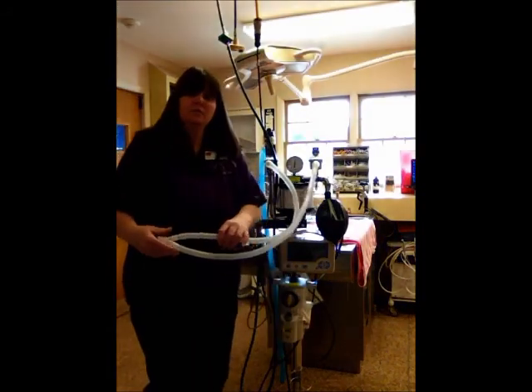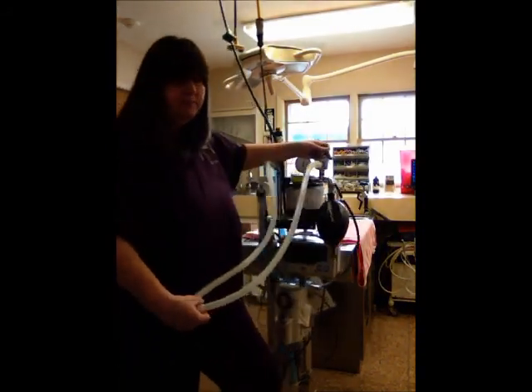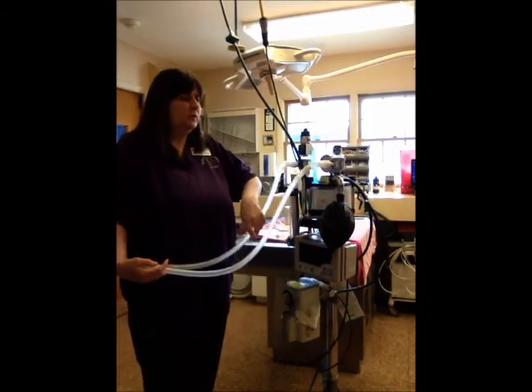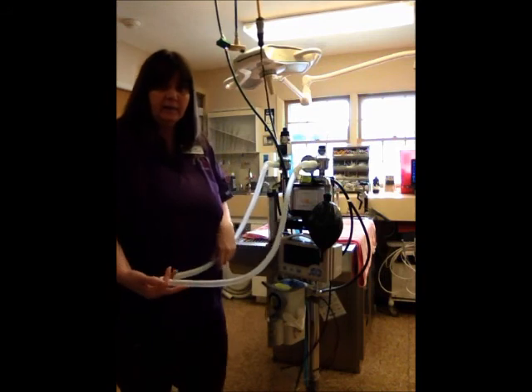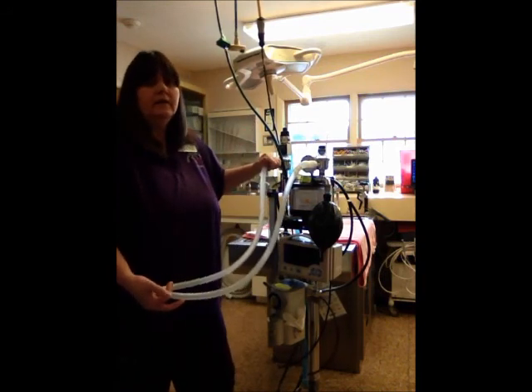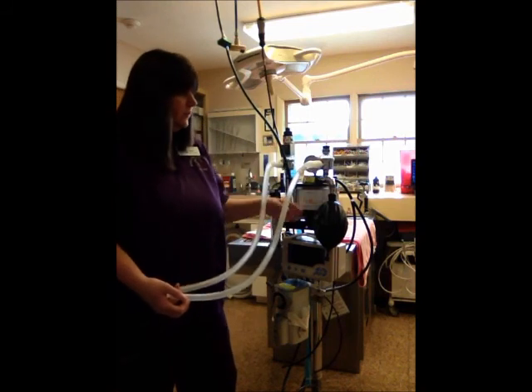Okay, so we're going to test our anesthesia machine. The anesthesia machine should be tested every morning. Ideally, in a perfect world, it's tested before every procedure. However, if that is not possible in your hospital, then it should definitely be tested every time you change the machine, the tubing or the bag.